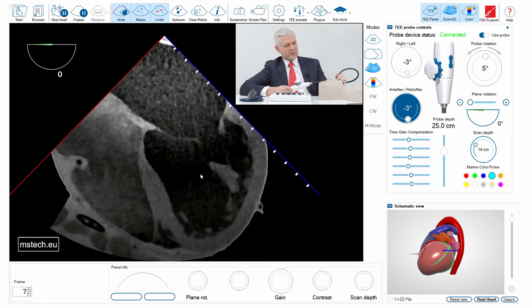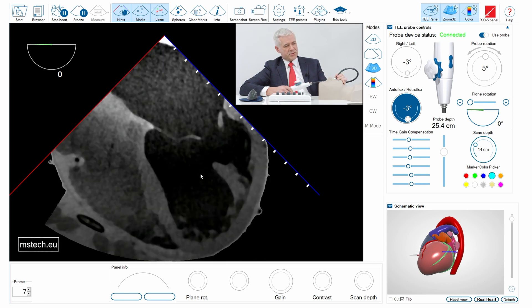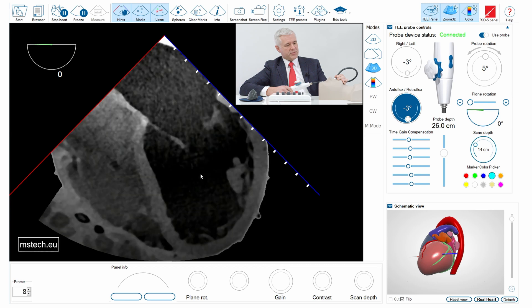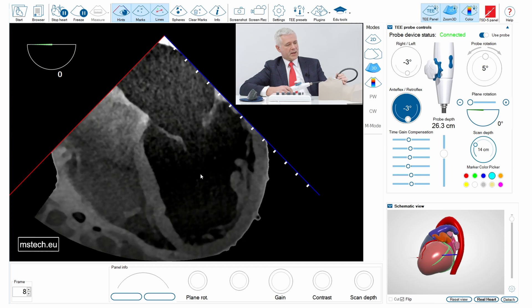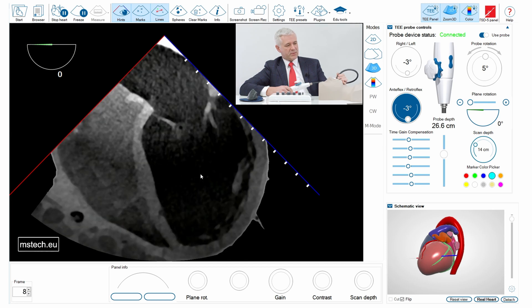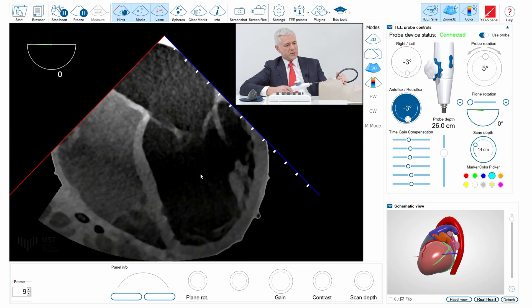Here we have the five-chamber view, then the four-chamber view, and as you can see there is a mitral valve prolapse visible here.